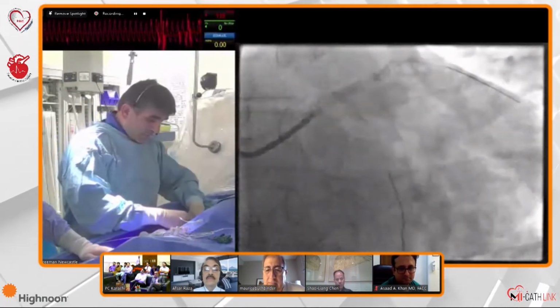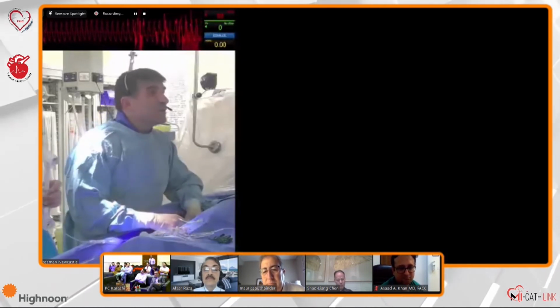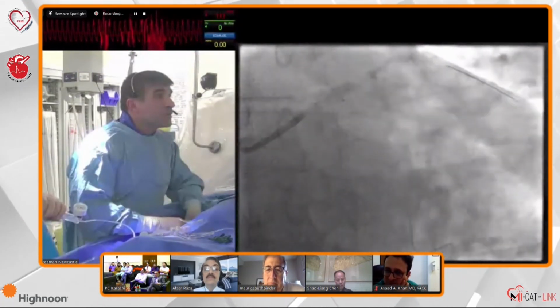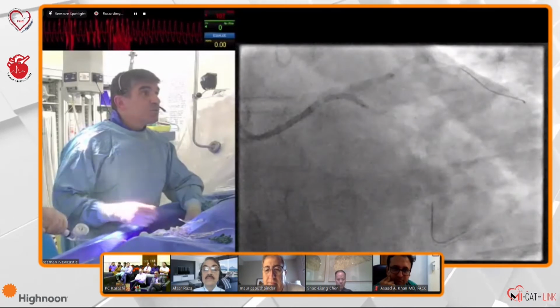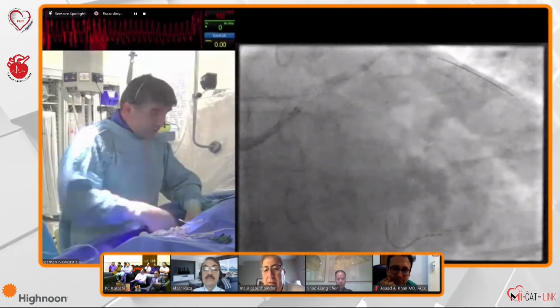Yeah, to cross. Absolutely. I take quite often, even for pre-dilatation, a non-compliant balloon, but for this case, I use a normal balloon. See, it's crossed very nicely. Go up there. That's beautiful. Go to 20, 24. Okay, can you go to LAO caudal? I want to see the ostial circ.